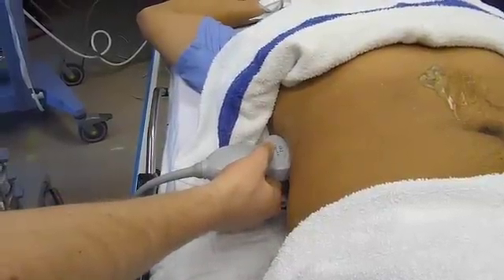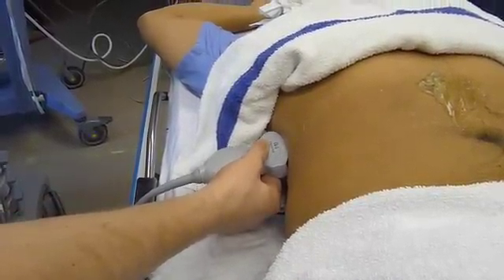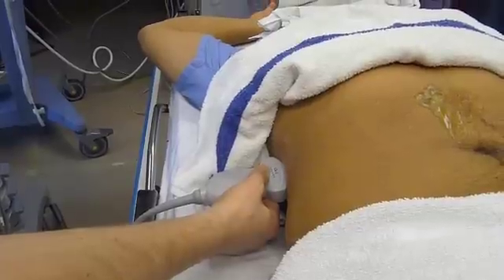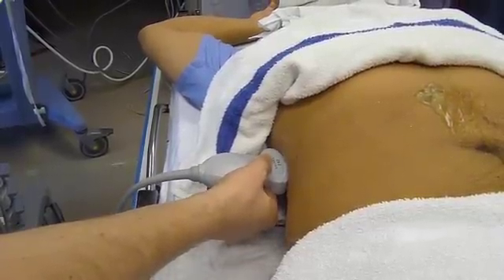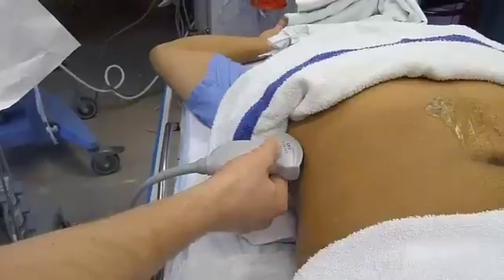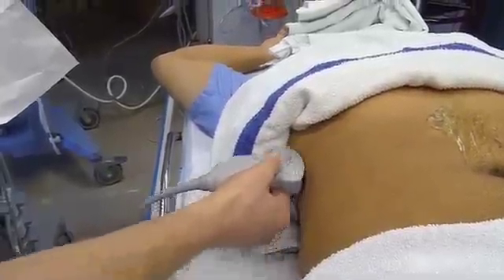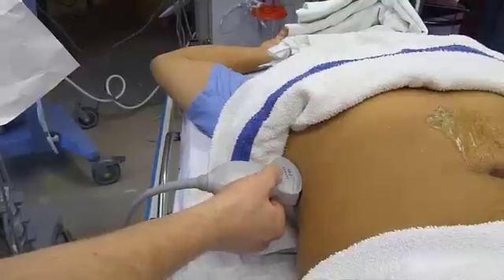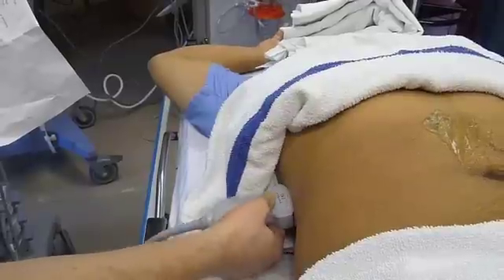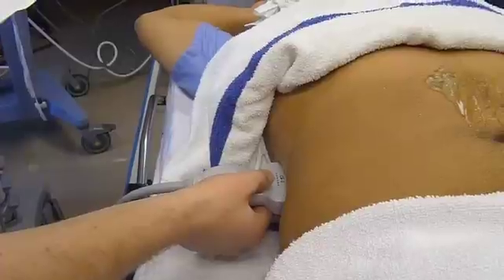As you make your AP move, don't let your probe get away from being parallel to the floor. Here I'm tilting it up slightly — that's not what you want. You want to be nice and parallel to the floor, just like I am right here. Another common mistake is allowing the probe to follow the curve of the patient's body. Practice keeping the probe nice and parallel to the floor.